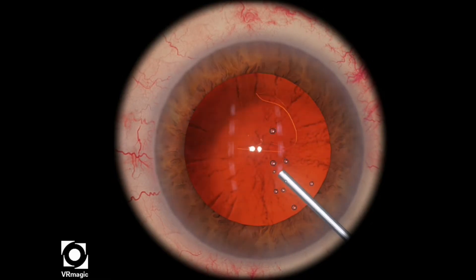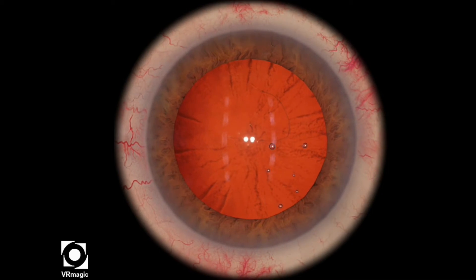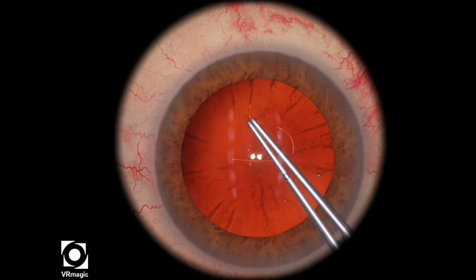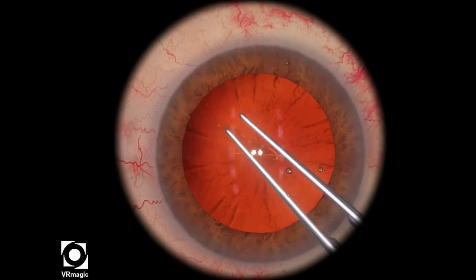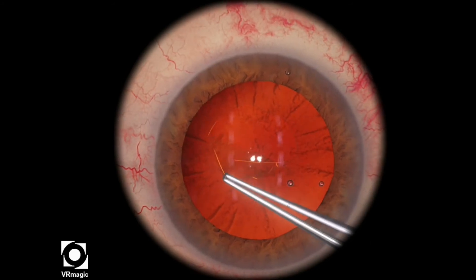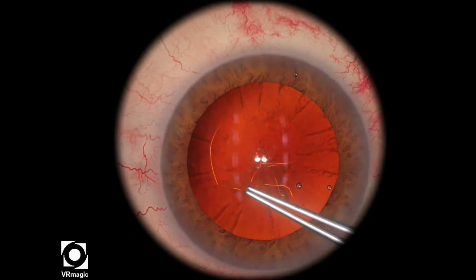In this particular level, your job is to rescue this errant tear and then complete the Capsulorhexis, making it as round as possible. You're going to use Little's rescue maneuver and pull the Capsulorhexis a little bit more towards the center so that you can create a more circular, round Capsulorhexis, even though there is a little area that's run out.